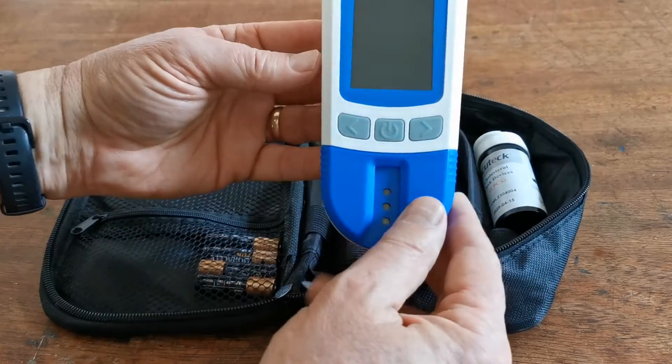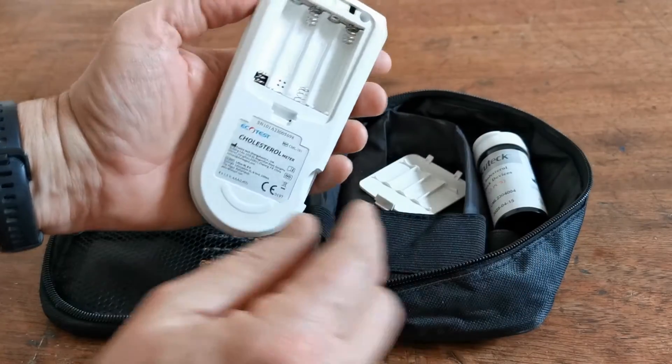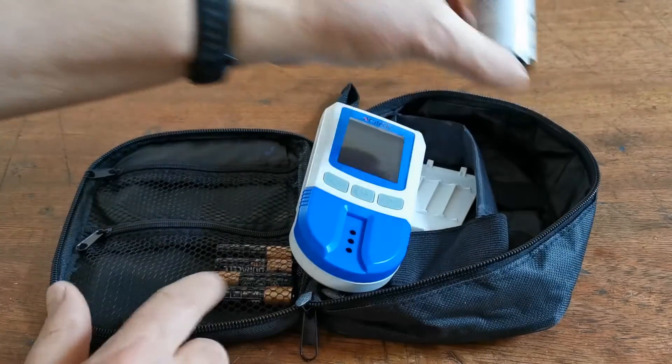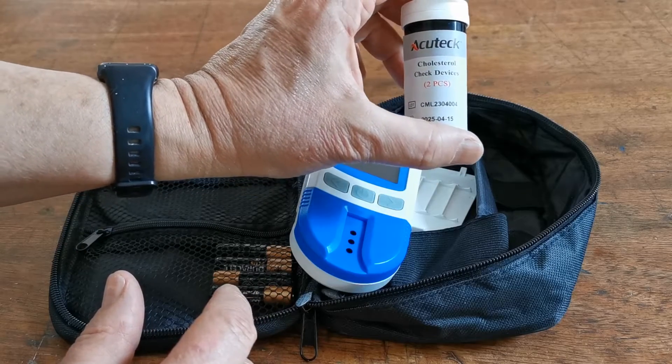The digital meter is a simple handheld device. The battery port is on the rear. There are symbols showing you the correct battery alignment in the rear of the meter. Also supplied will be the batteries and a pack of two cholesterol check devices.